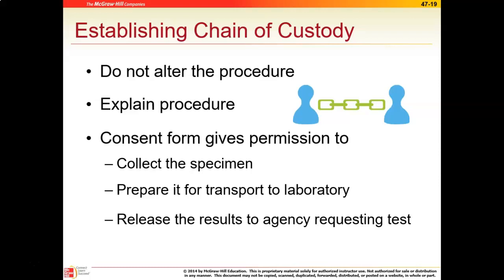Sometimes they put a blue coloration in the water of the toilet to make sure that somebody doesn't try to use toilet water or free-flowing water to affect whatever urine they have. Sometimes if somebody is using some sort of drug, they don't want someone to find out about it, so they'll do sneaky measures to try to get away with it. And so that's why you're not allowed to take anything in. There's been people that have tried to bring in other people's urine and use that as opposed to their own. So that's why there's a certain established set of protocols that have to be followed when obtaining these urines.